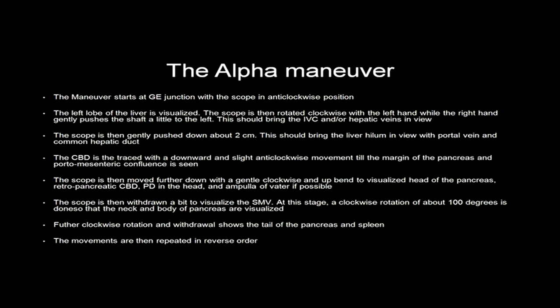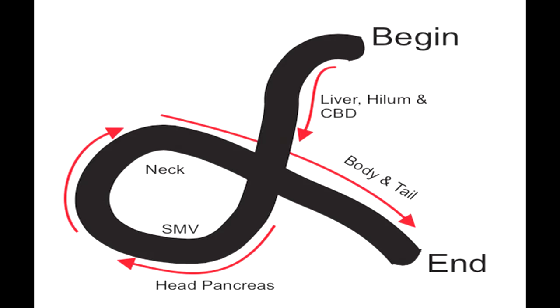We also see the retropancreatic common bile duct, pancreatic duct in the head, and the ampulla of Vater in many cases. The scope is then withdrawn a bit to visualise the superior mesenteric vein. A clockwise rotation of about 100 degrees is then done so that the neck and body of the pancreas are visualised. Further clockwise rotation and withdrawal shows the tail of the pancreas and spleen. The movements are then repeated in reverse order. The movement of the scope resembles an alpha loop — beginning at the GE junction, tracing down to the common bile duct and portal vein, taking a turn to visualise the head and superior mesenteric vein, then looping with a 100-degree turn to visualise the body and tail.